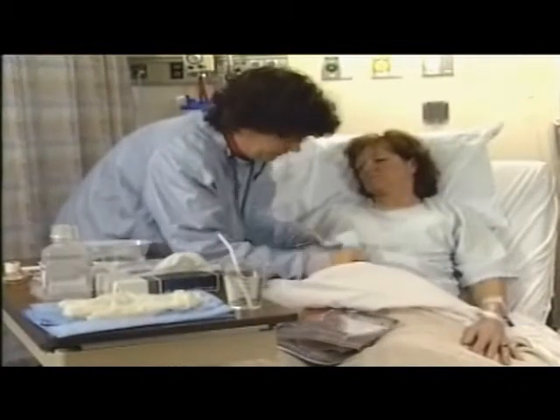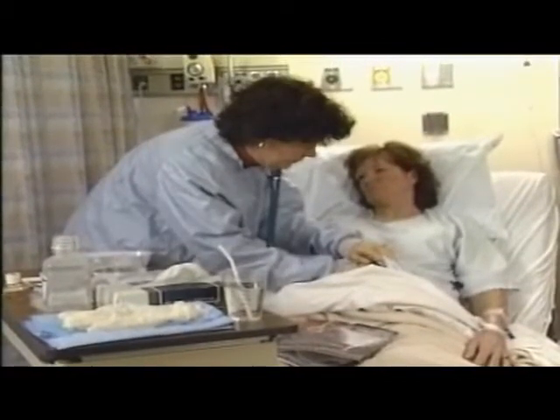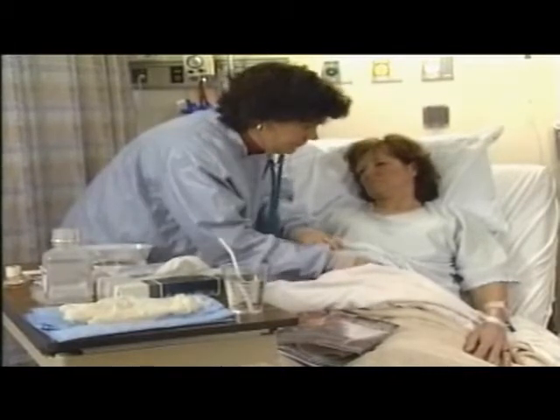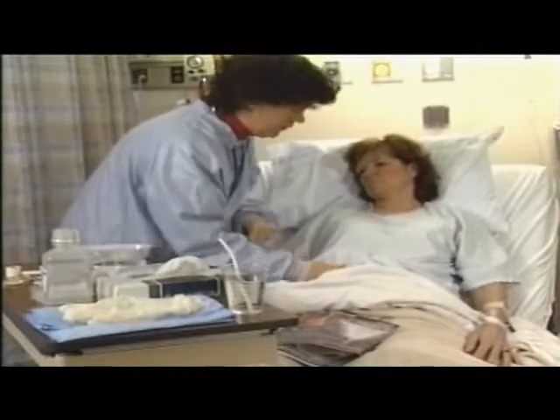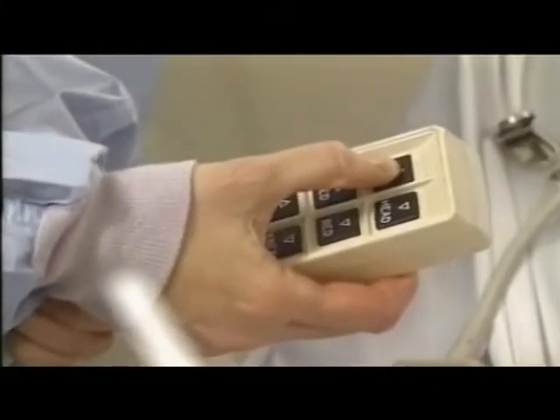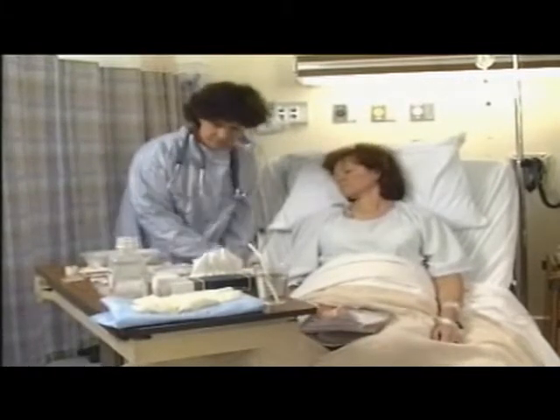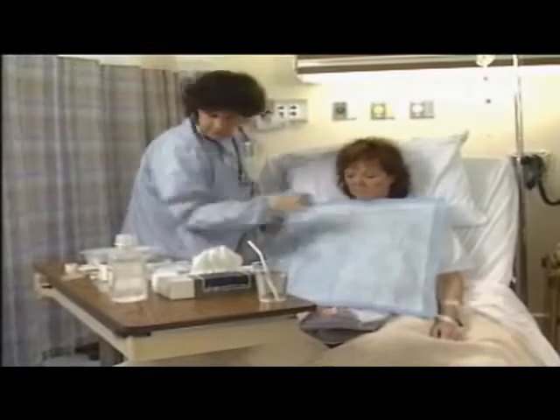Insertion of the tube begins with patient assessment. Observe the patient's abdomen for distention. Auscultate for absence or presence of bowel sounds. Palpate for rigidity and pain. Raise the head of the bed to a high Fowler's position if health allows, so the tube will slip down more easily. Support the head with a pillow. Swallowing is easier in this position and gravity will help in passage of the tube. Place a towel or drape on the patient's chest and provide the patient with a tissue and basin.